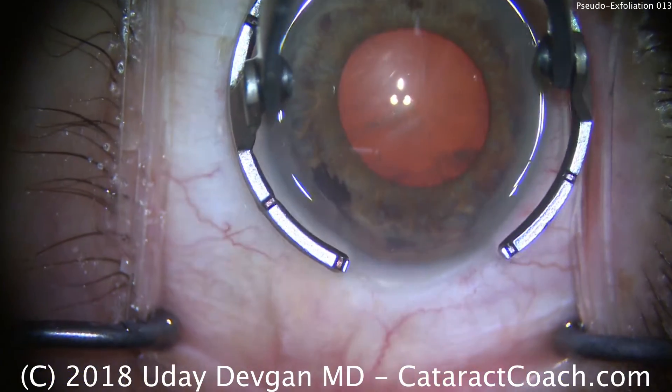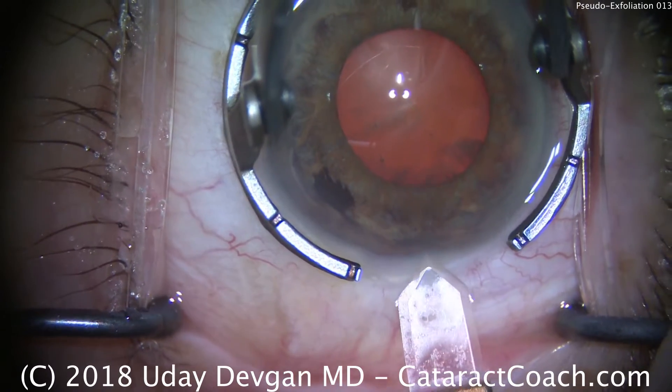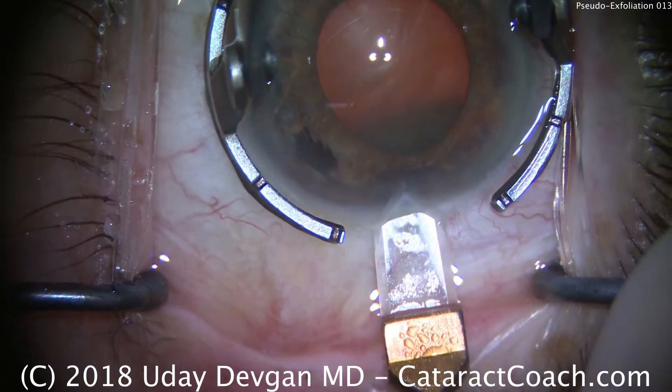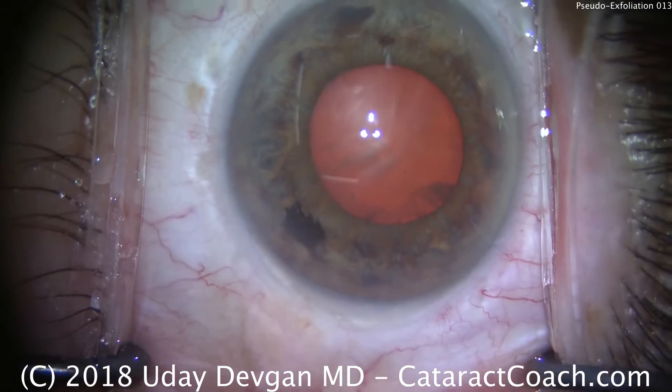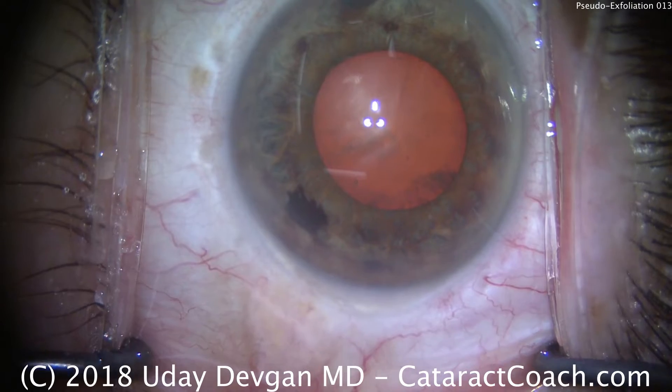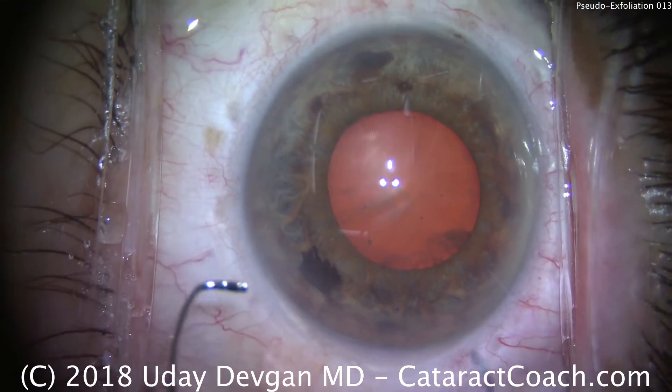We'll make our main incision. These patients can have a host of issues associated with the cataract due to the pseudoexfoliation. There can be glaucoma. The pseudoexfoliation can also lead to loose zonules, which can lead to a shallow anterior chamber. Poor dilation is also a factor.